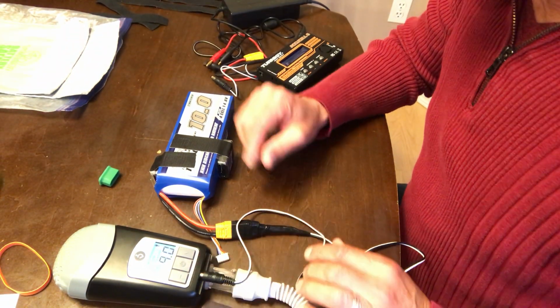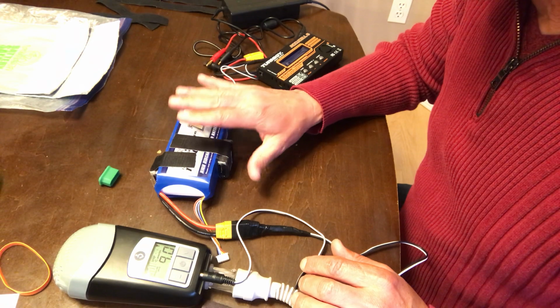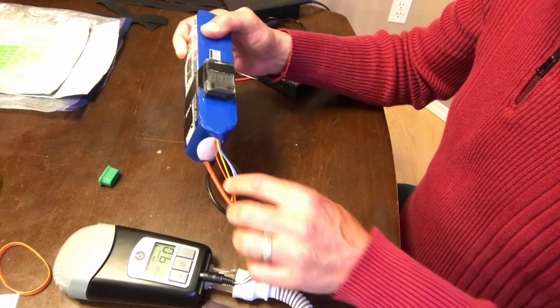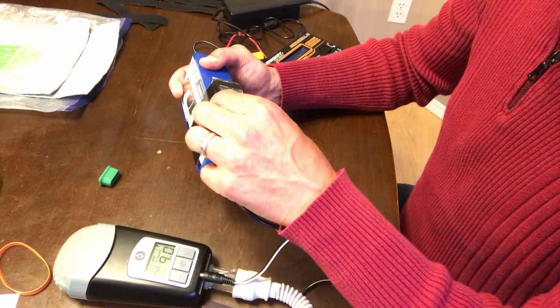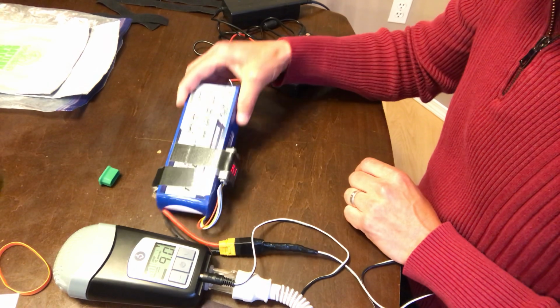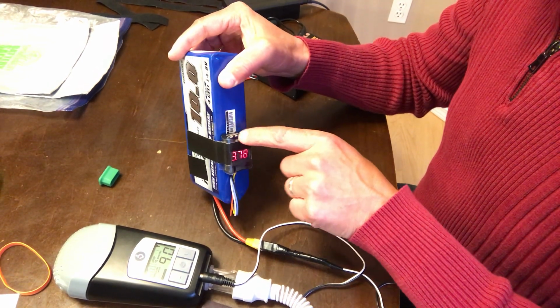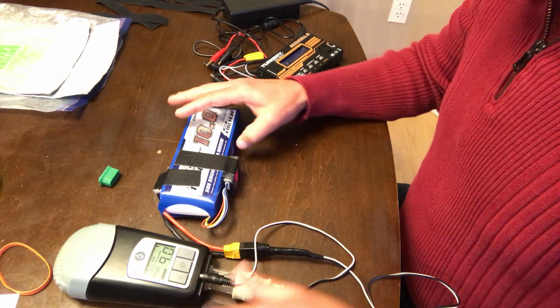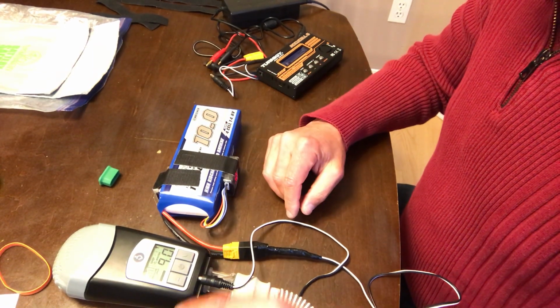And away it goes. So now it's running on battery only. And again, you still have access to this USB charger. So if you wanted to charge your phone, you plug that in there, and now you're charging your phone as well. Okay? So that's mobile out in the woods.